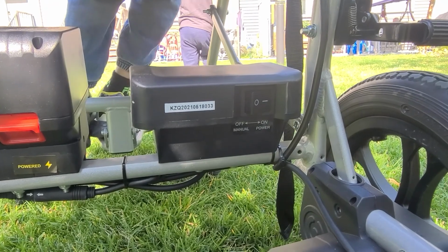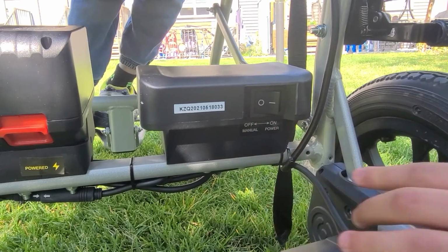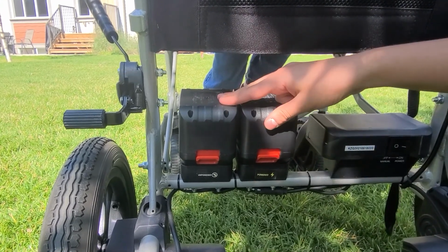On the back, there is an on and off switch. On is for the power, off is for the wheelchair to turn into a manual wheelchair. Here are the batteries. This one is for the power wheelchair, and here is just an extra battery.